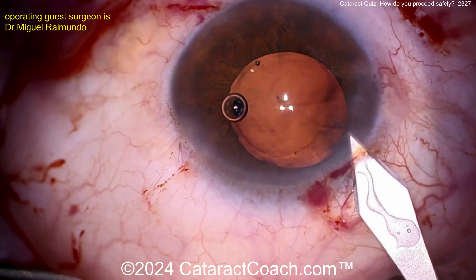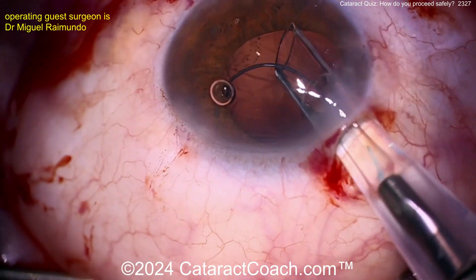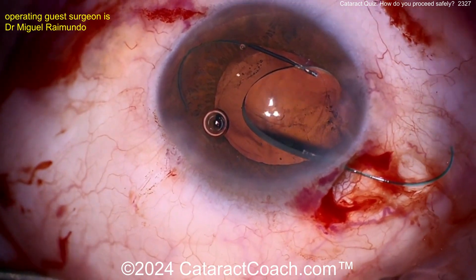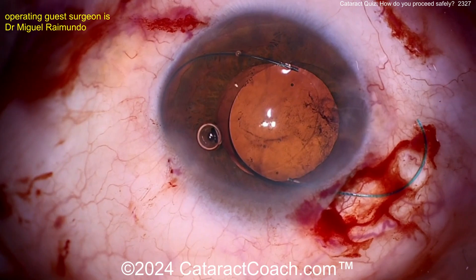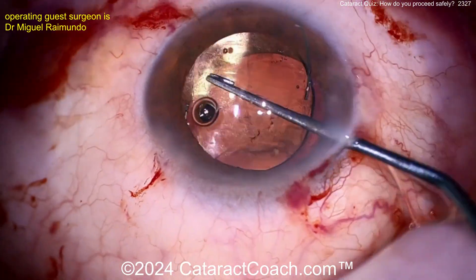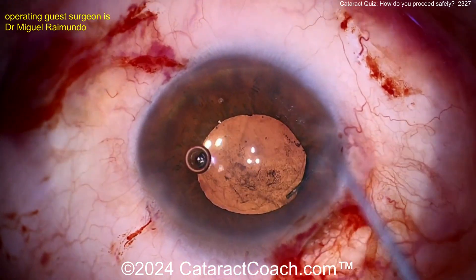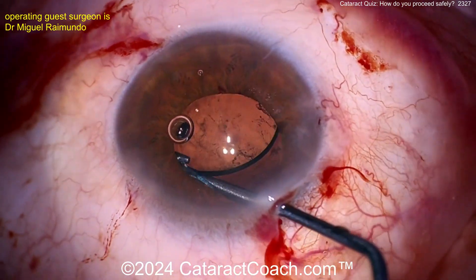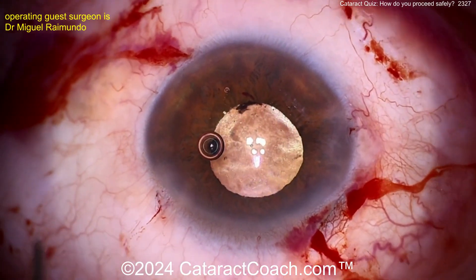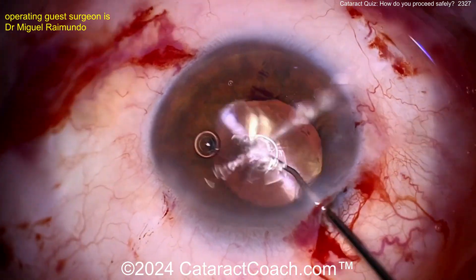No incision enlargement — that means a three-piece lens is coming in. Three-piece lens: haptics in the sulcus, optic captured behind the capsulorhexis. A great technique here: inject the entire lens on the iris first — don't worry, it won't stay there. You can then gently dial it into the sulcus, taking your time. Dial that haptic right into the sulcus, rotate it, get the other haptic in the sulcus too. Once done, perform optic capture — that's a beautifully stable eye. That lens is going nowhere.